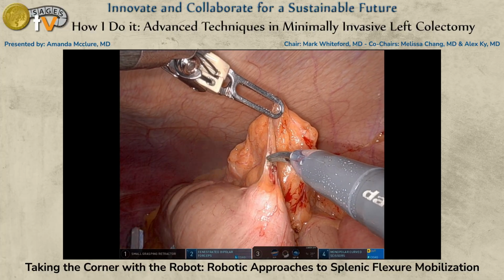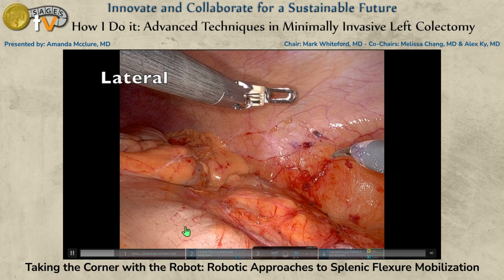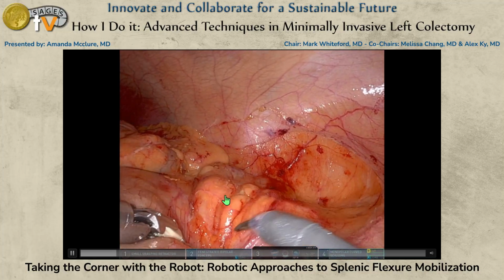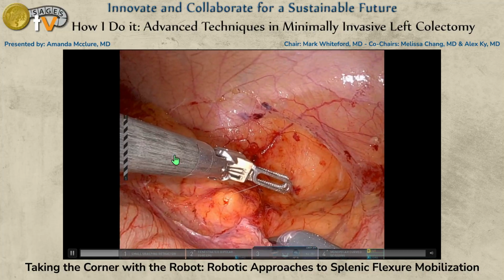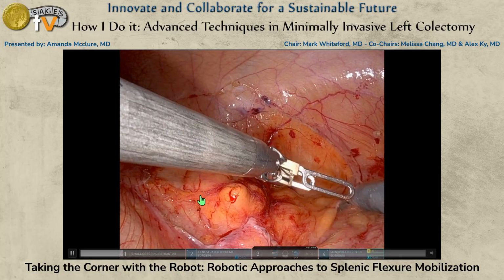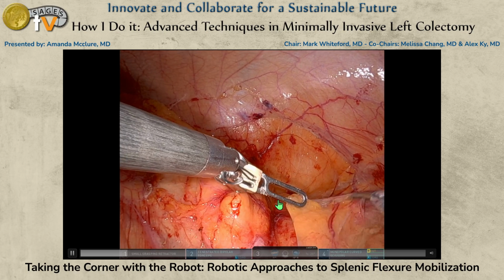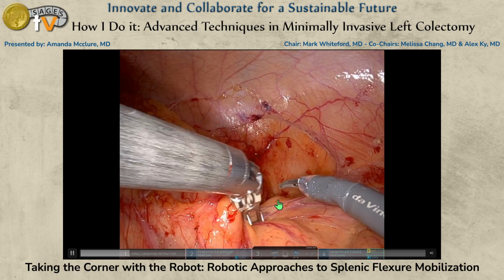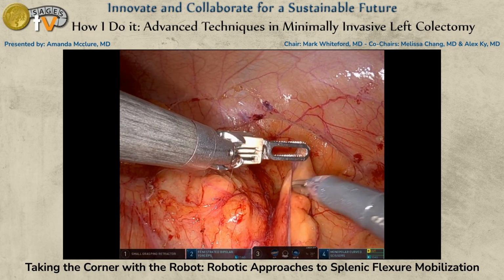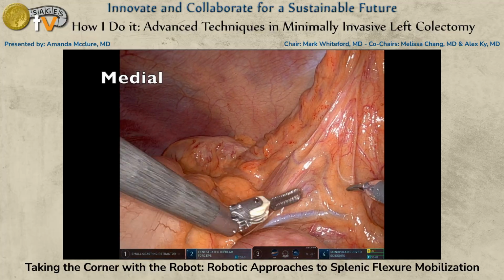You're wanting to pull down with your arm. You can see that down here I'm pulling down with my arm, or laterally. So you want to stay in front when you're using your 2 arms to prevent collisions. You want to keep your small grasping retractor ahead of your bipolar or underneath it. That will prevent your collisions. But you can see there's not a great lateral plane here. Like usually this will pull apart, but some patients are sticky. They don't all come with easy flexures. So we just have to be able to be flexible and move with whatever they give us.